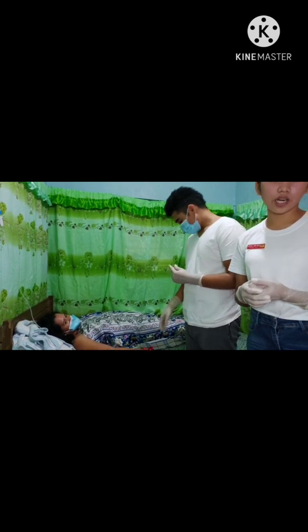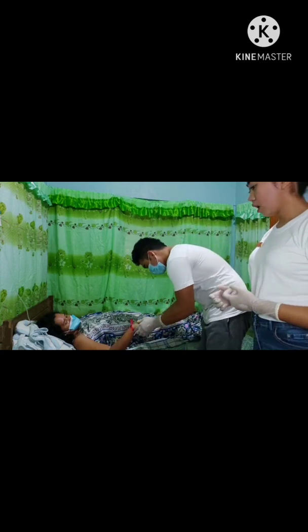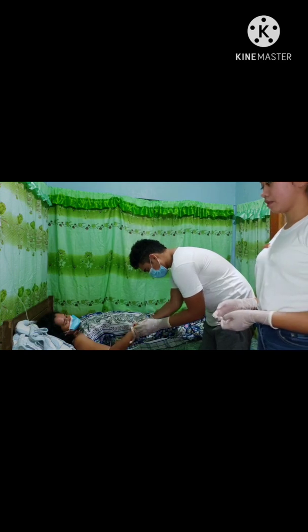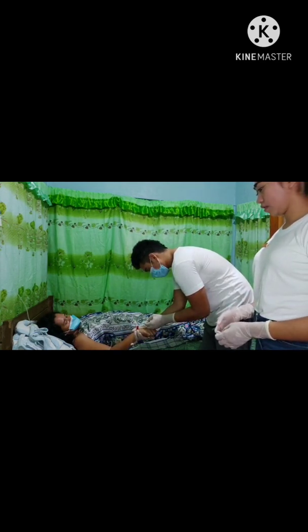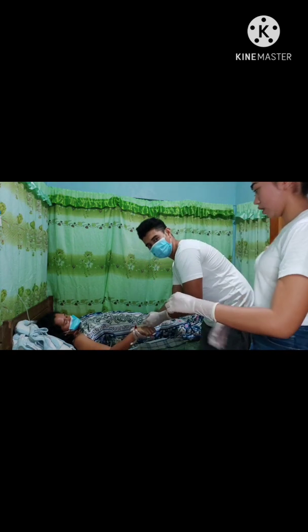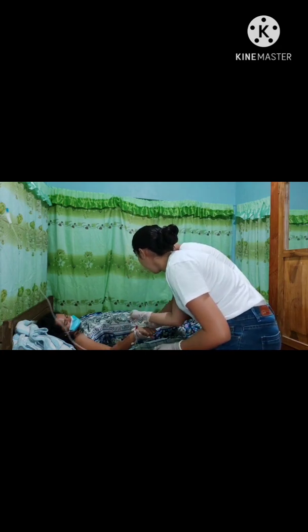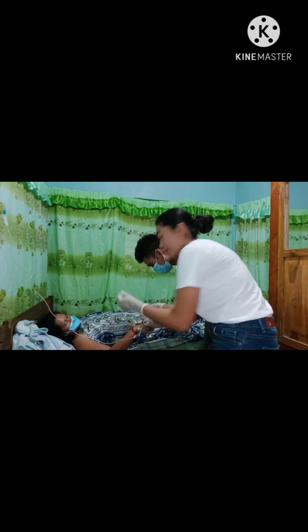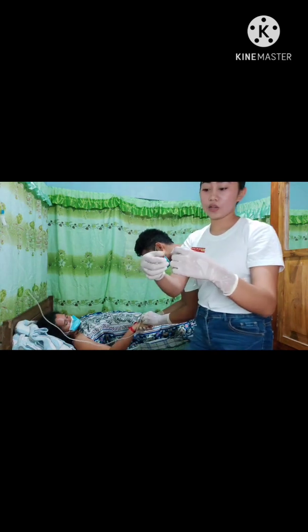So once the doctor has located the vein, we should prepare the tubings and the tape. And then connect the tubings to the cannula and put the tape where the cannula is to secure it.